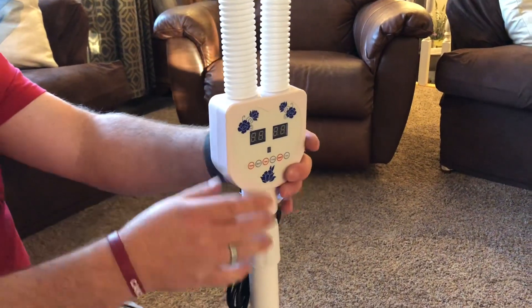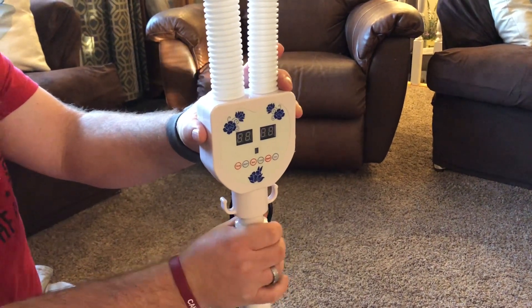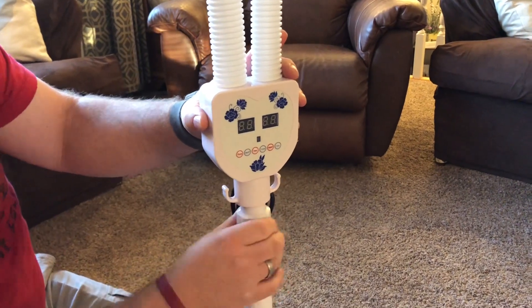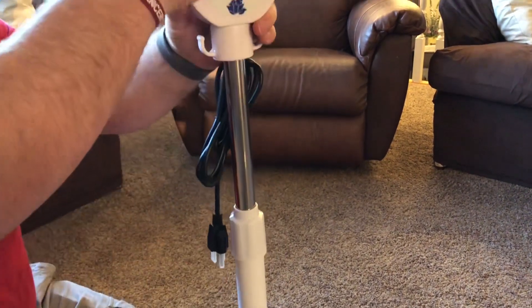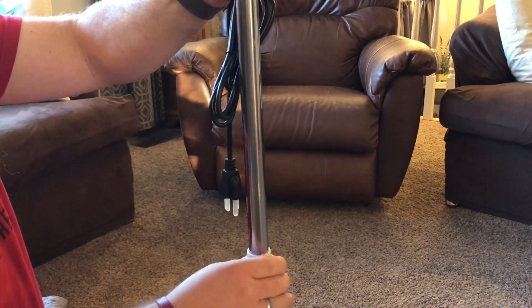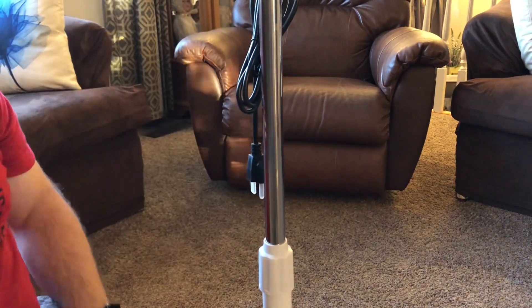This will pivot on the post so it can turn around. If you want to adjust it, you can loosen up this piece and raise it up, then tighten this back down. Just like that, I was able to make the lamp taller.